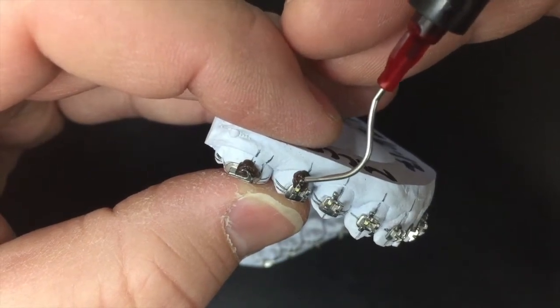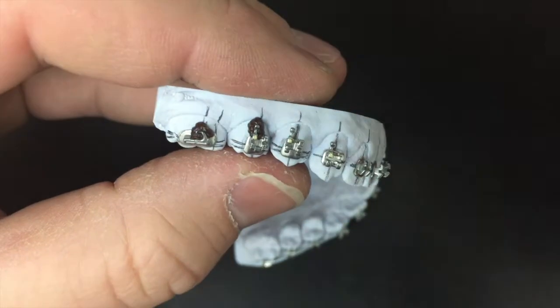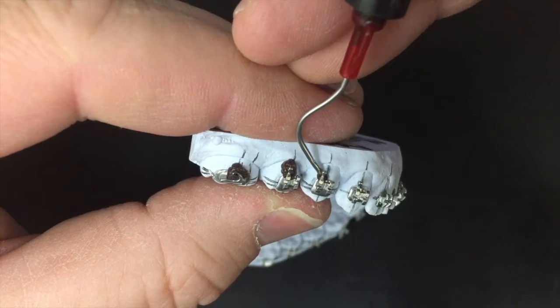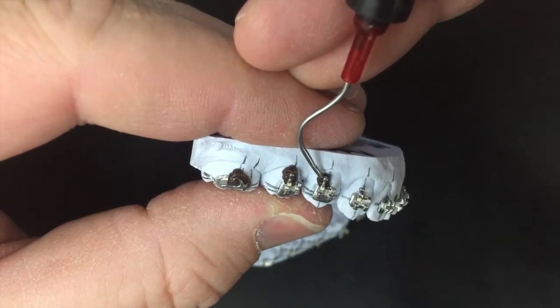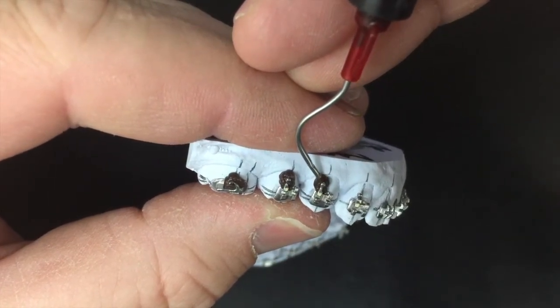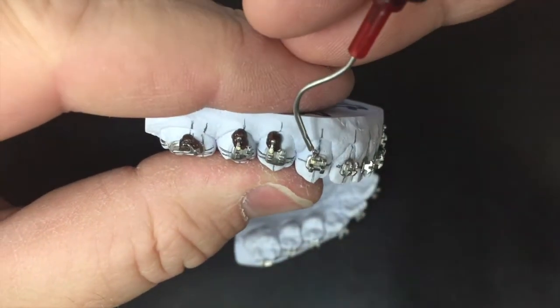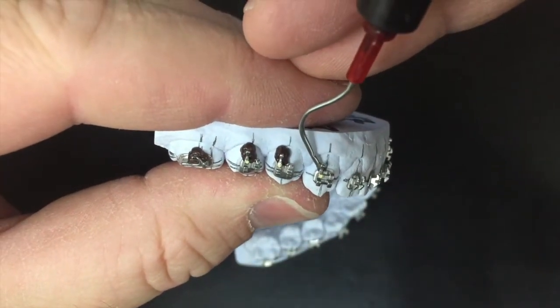So the assistant will do the tray, put it on the patient, bond everything, and then go to remove the tray — and it'll pull the brackets right off. That's the reason why we do it.